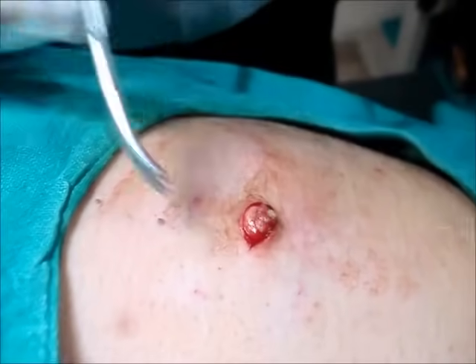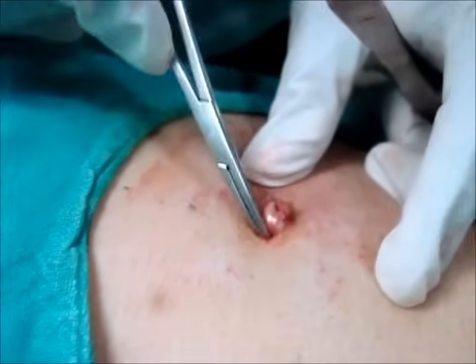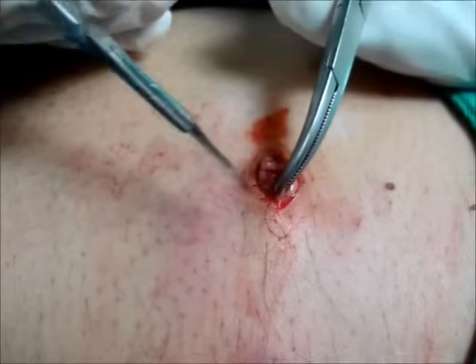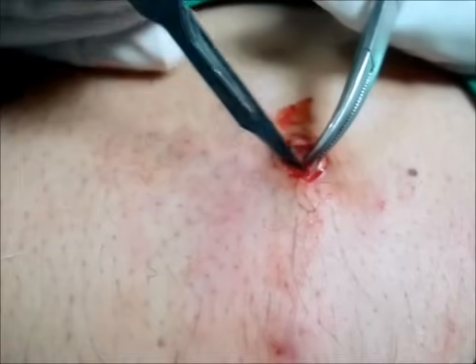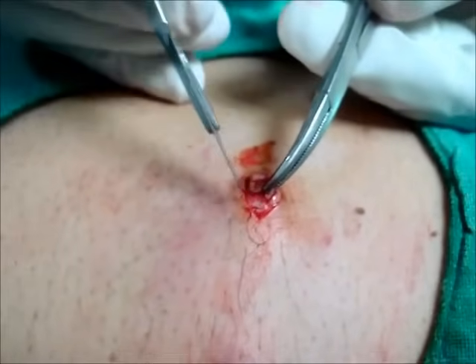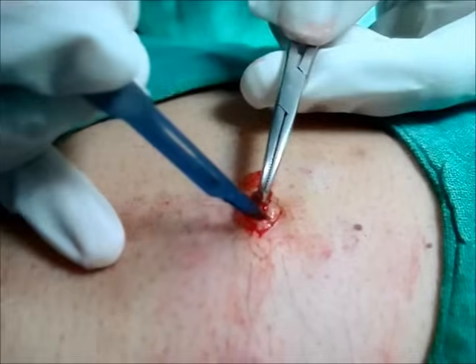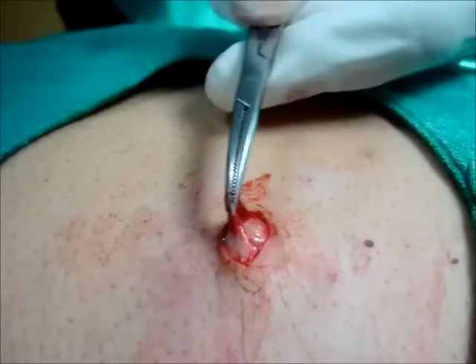Just watch the video and see the steps — how this cyst is getting removed completely. I am creating a plane between the cyst and the skin, trying to hold the skin that is to be removed and creating a plane between the cyst wall and the skin. Now you can see the cyst is gradually coming out.